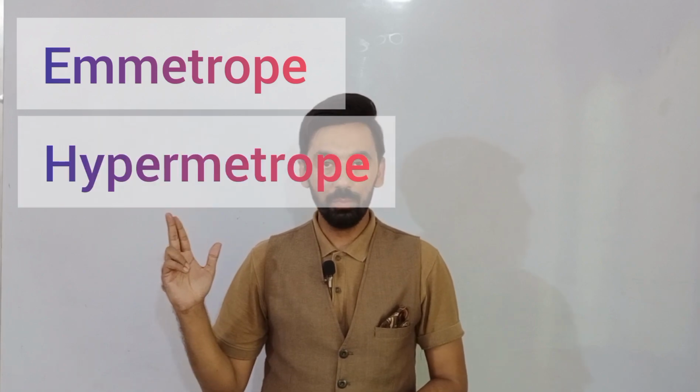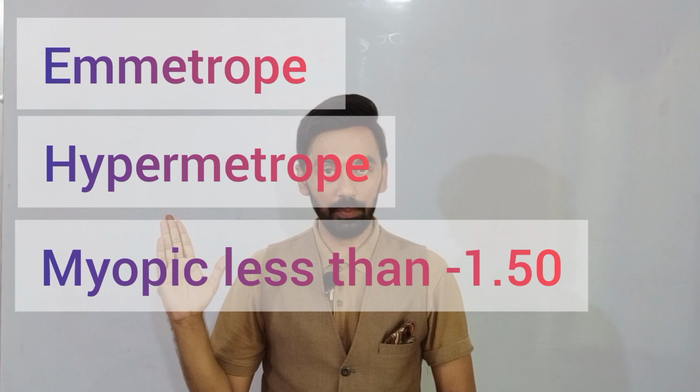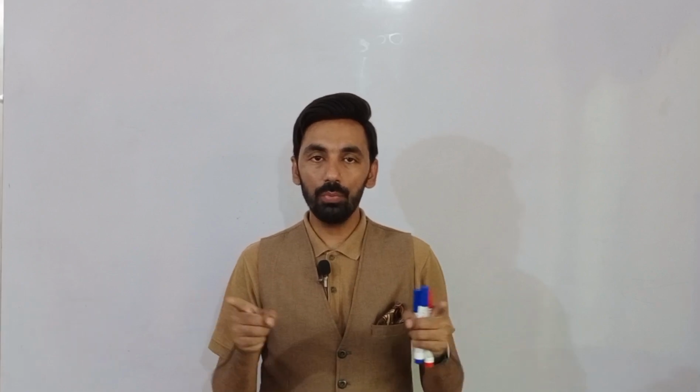And when the reflex and the streak are moving against, opposing each other, that movement is called against movement. We will find with movement in a normal person like an emmetrope, in a hyperopic patient, or in a myopic patient as well. But the condition is, in a myopic patient, the myopic correction should be less than minus 1.5. In all of these conditions, like emmetropia, hypermetropia, and myopia less than minus 1.5, we will find with movement.